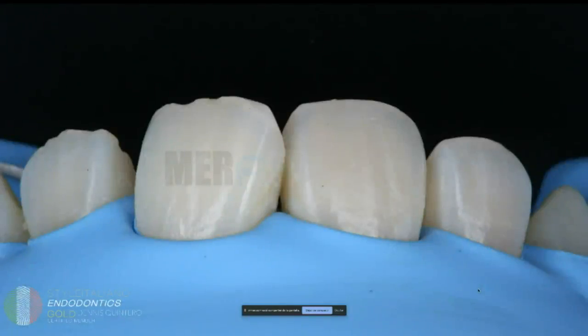And now to conclude the case, after 15 days, after doing the endo treatment for 1.2, I also removed part of the gutta percha that we have on the crown of 1.1 to avoid any discoloration of the tooth. But as you can see, for the isolation, I make a multiple isolation.